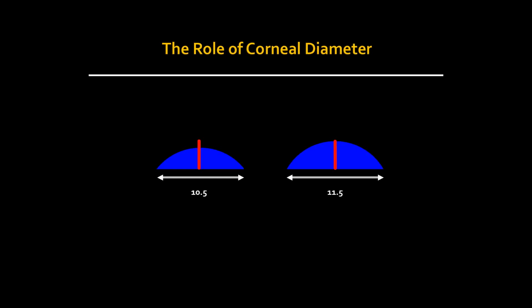In this very rudimentary example that I have shown here in my pictures, we can see that if I hold base curve constant, and I hold corneal eccentricity constant, and we're only adjusting the diameter, the same sagittal depth I have here corresponding to this larger diameter cannot be superimposed on this smaller diameter eye on the left. So we do have a difference in sagittal height, and ultimately, that would make sense, that a lens that would fit on this 10.5 diameter eye may not necessarily fit the same on this 11.5 diameter eye. If that's the case, what does this mean clinically?